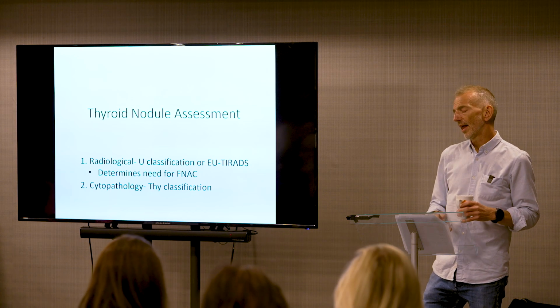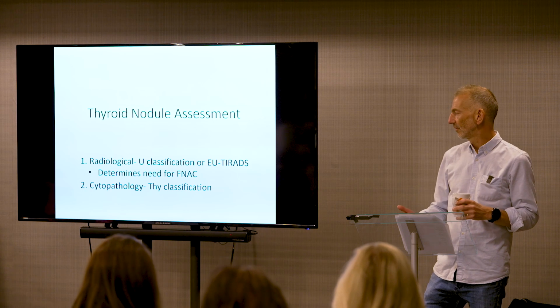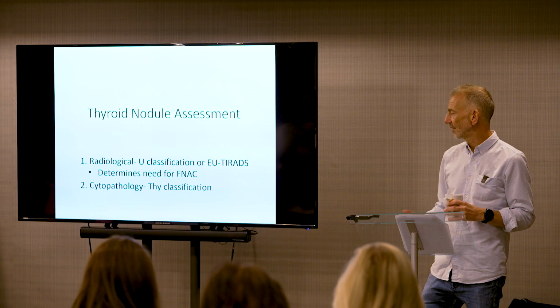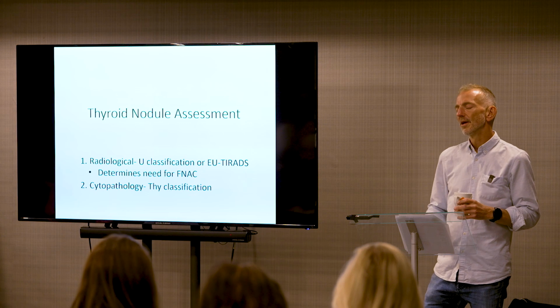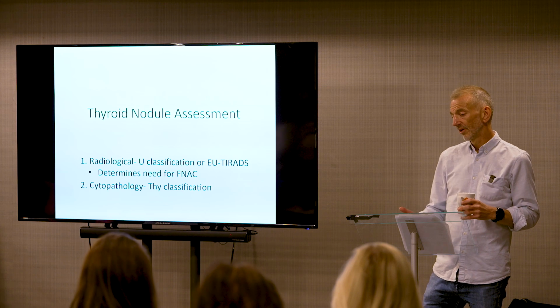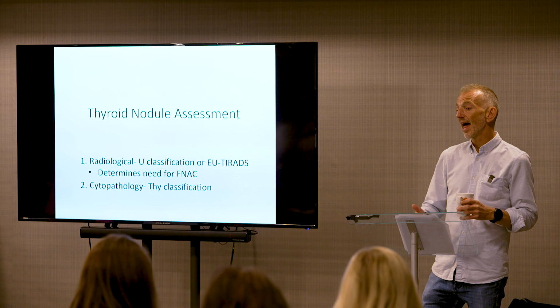So, there's a bit more to it than that, and people describe using ultrasound alone or in concert with the cytopathology to help risk stratify different thyroid nodules. But put simply, and this is sort of 99% true anyway, the purpose of the ultrasound is only to describe the nodule as you see its size and characteristics, and therefore determine whether FNAC is required.